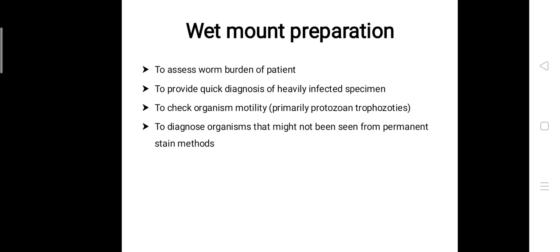Also, a very brief introduction. Stool is the most common specimen which is brought to the diagnostic laboratory. The most commonly performed procedure in parasitology is the ova and parasite, or that is O and P examination.